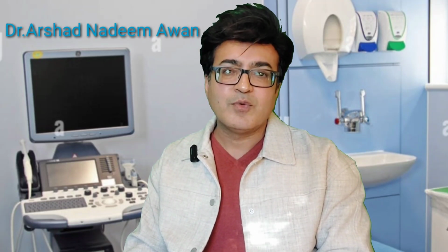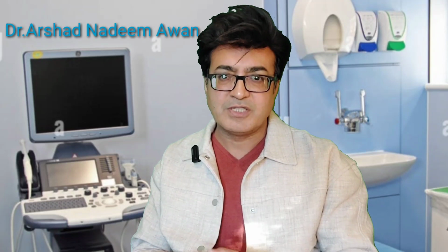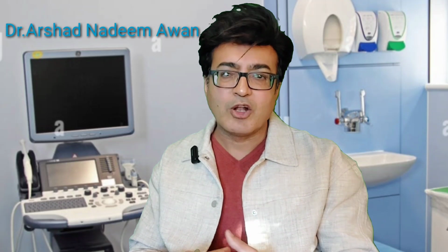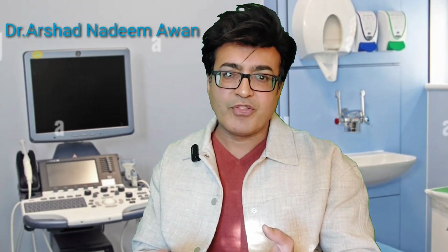Today I'm going to start one of the topics, the urogenital topic, or in other words kidney, ureter and bladder. Before jumping into the pathological processes, I would suggest that we first look at the anatomical structure, the radiological anatomy, how many parts the kidney, ureter and bladder have, and how they appear on ultrasound imaging, so that we get an idea of the normal presentation of the renal system. Once we understand the normal renal system, we will be able to easily pick up the pathological processes.